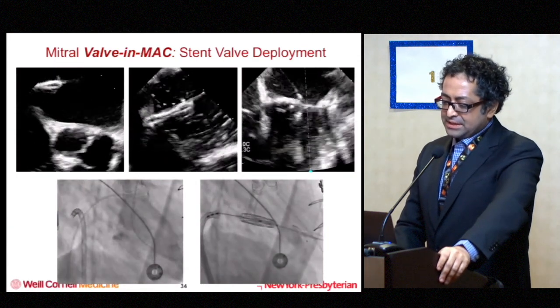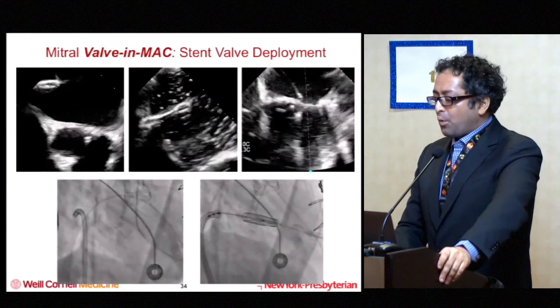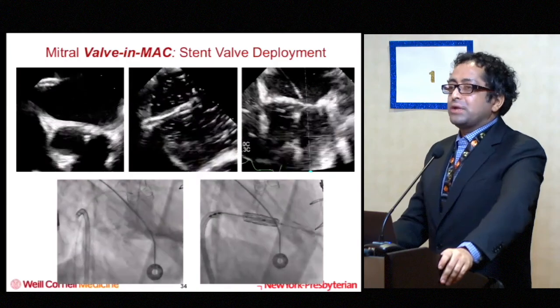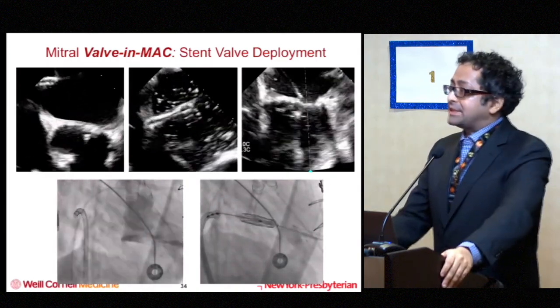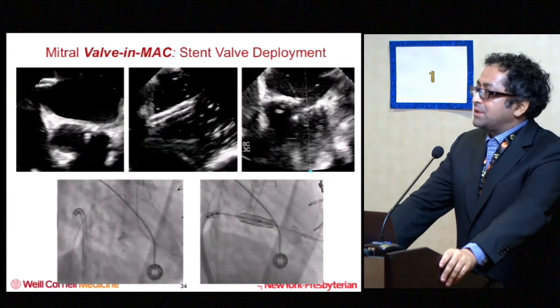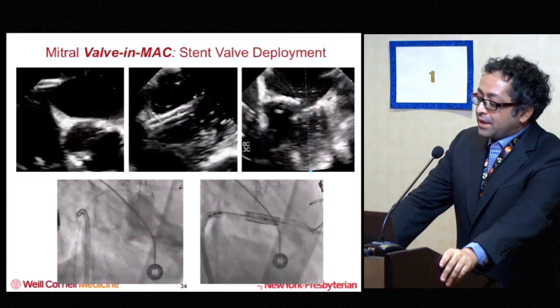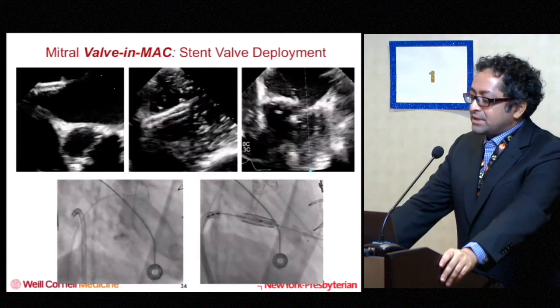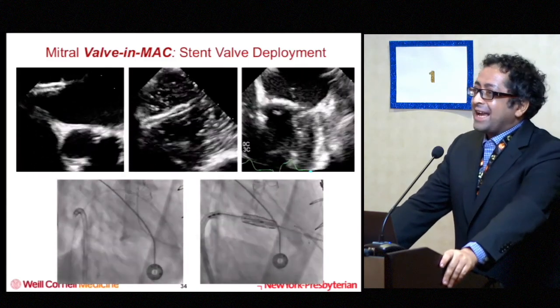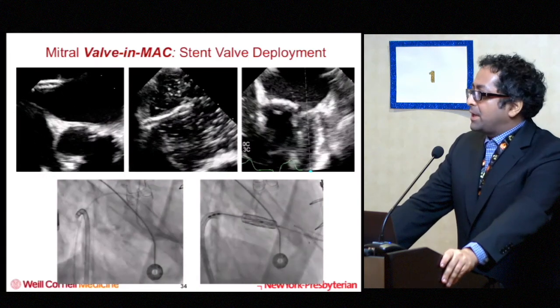And in this patient, same sort of thing. You get the same positioning exactly like before. But where you put the valve in relation to the left atrium to LV is anyone's guess. The biggest thing you're looking for is really not to cause that LVOT obstruction. You should have done that pre-planning beforehand. And when you're getting the valve in place, often the echocardiographer will say, hey, this is looking like it's already too far into the LVOT, maybe come back a bit.